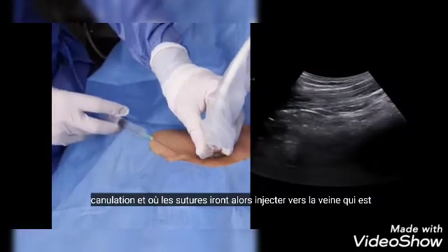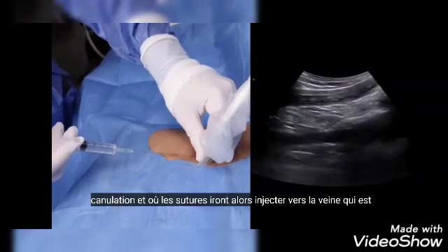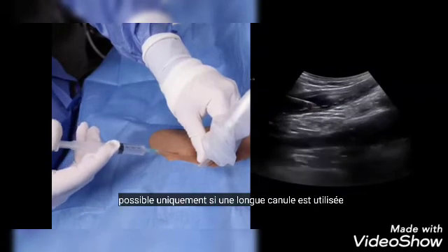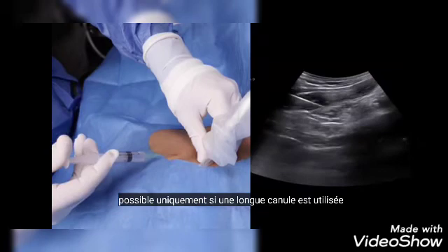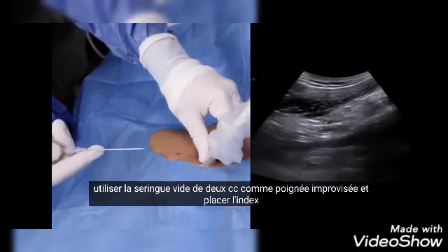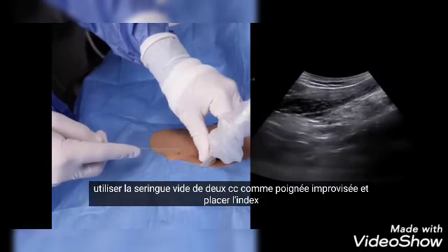Start injecting local anesthetic a few centimeters away from the edge of the probe, making sure to cover the point of cannulation and where the sutures will go. Then inject towards the vein, which is possible only if a long cannula is used.